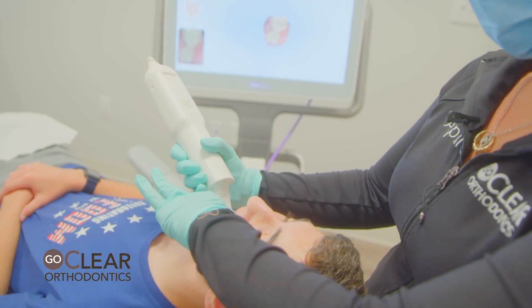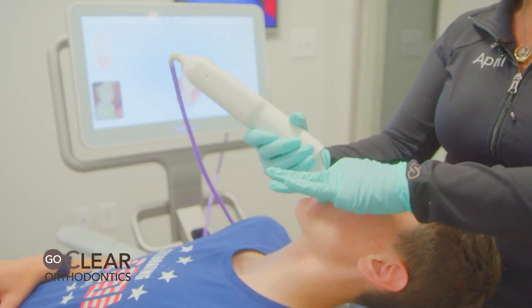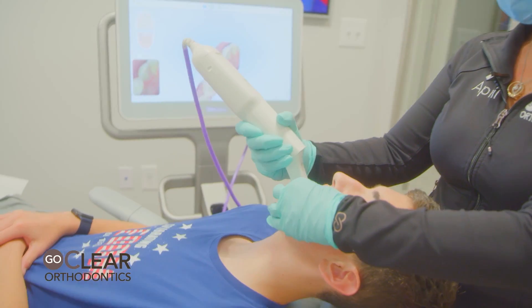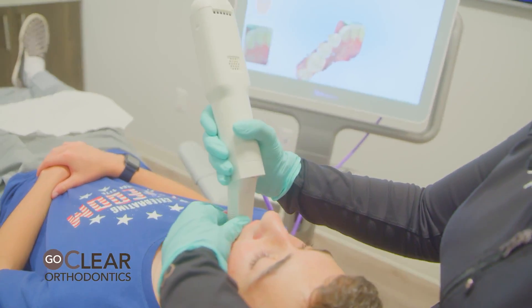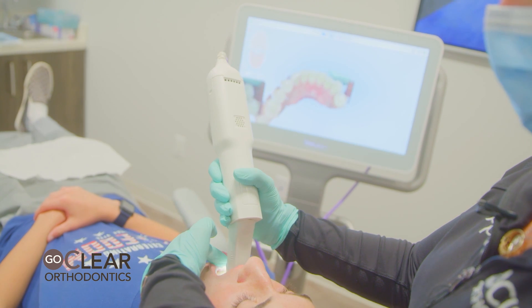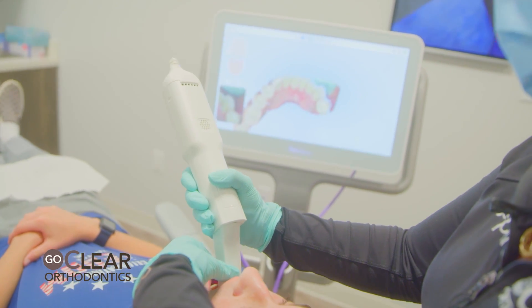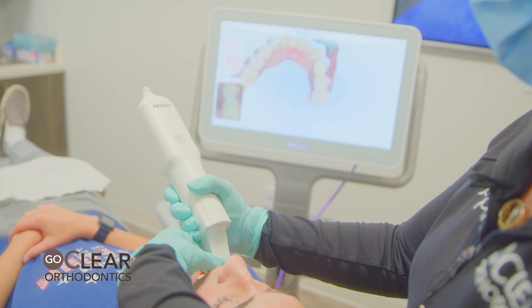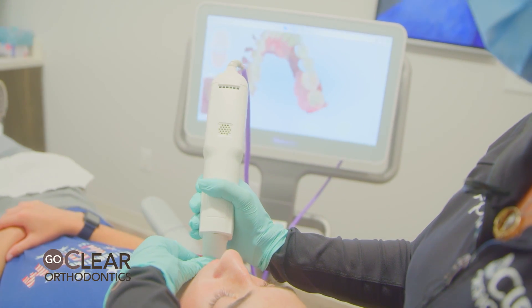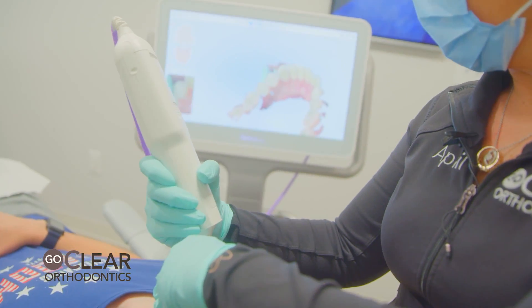I'm supporting it with my index finger and my thumb. I'm going to come straight forward on the occlusal surface as my index finger holds the lip away. Once I see the canine, I'm going to tilt the wand towards his forehead and go straight across the lingual. The whole time, my index finger is walking with it and holding that lip out of the way. Once I see the lower right canine, I'm going to tilt the wand tip back down and go straight back. Then I'm going to roll in towards the tongue without stopping and go all the way back to the lower left, just getting the lingual.